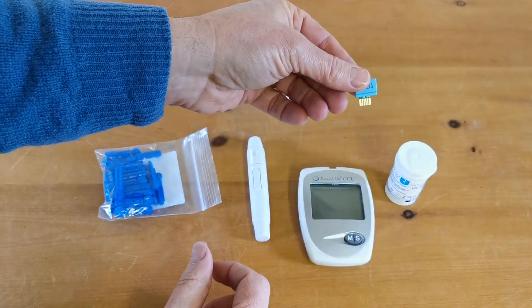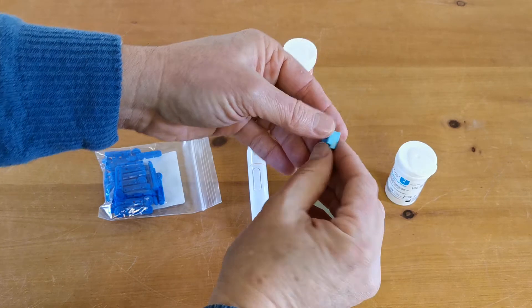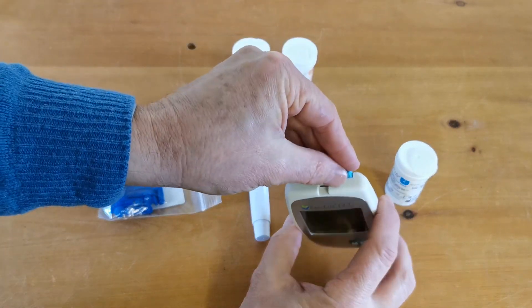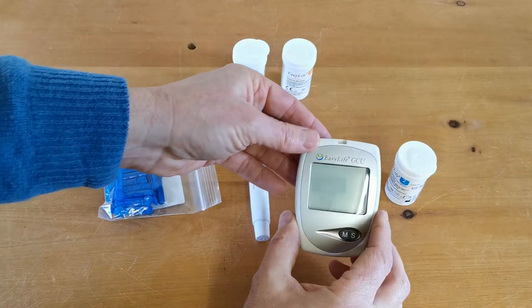You need to transfer the calibration information on the code chip into the meter each time, and to do that you use the port on the top of the meter and apply the code chip into the top.